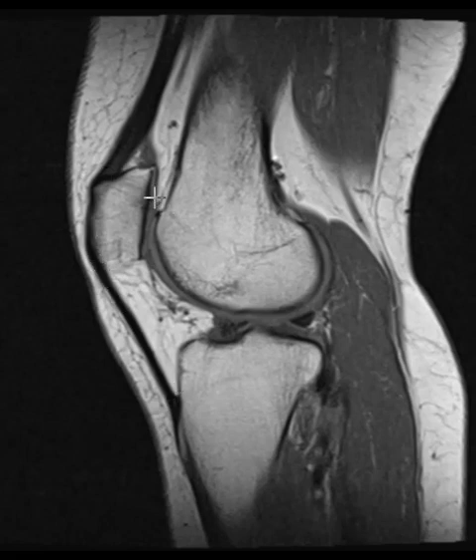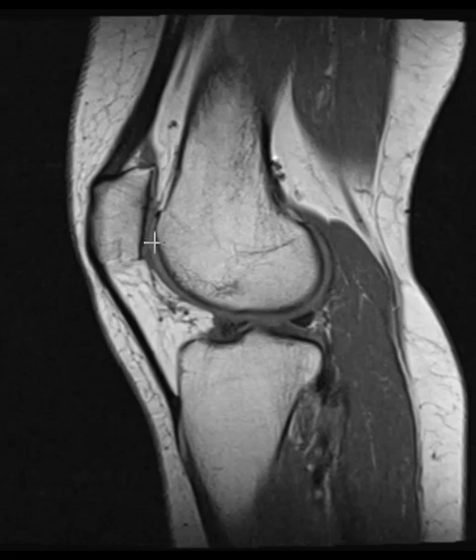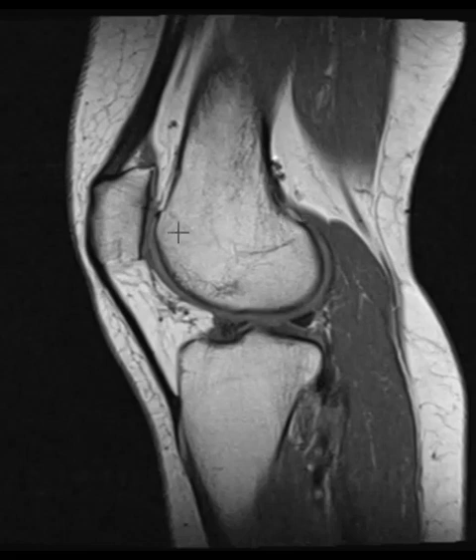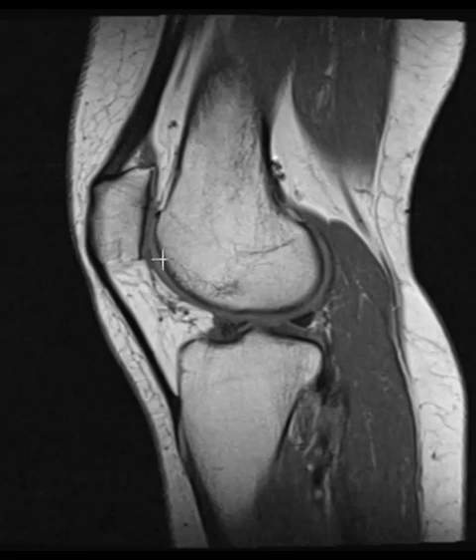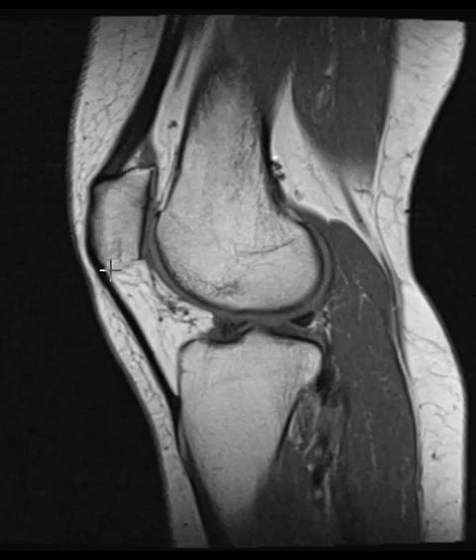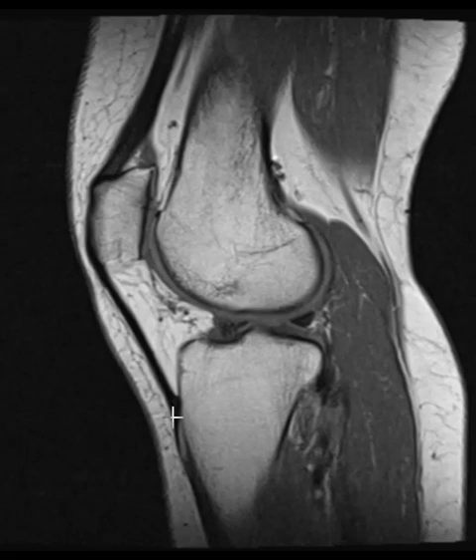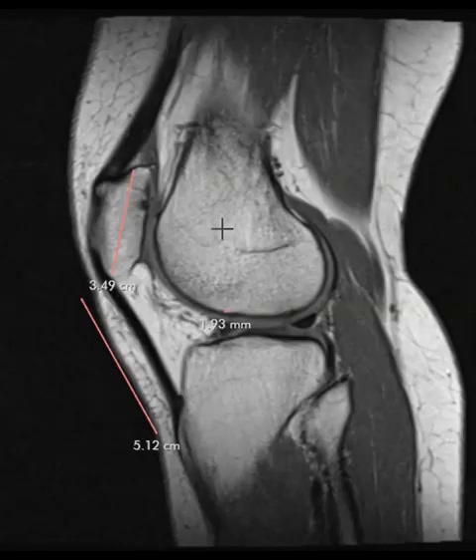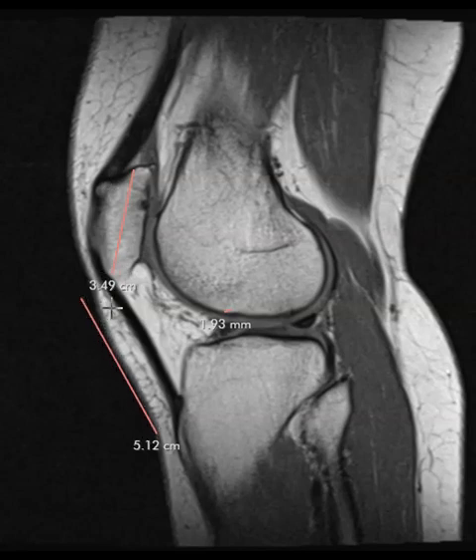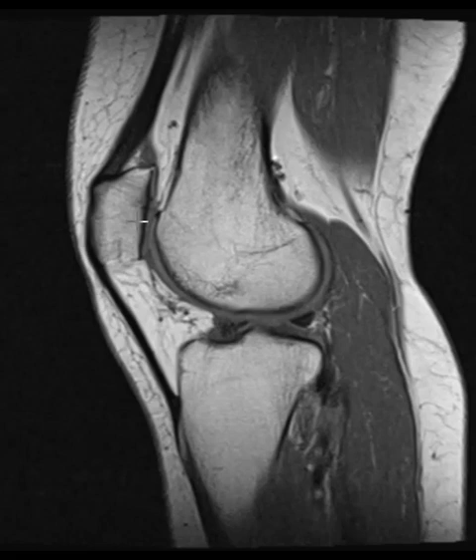We see that it is in normal position. The articular surface in back is articulating with the front of the femur here. We see the gray cartilage. The epicenter of the patella is right here and it roughly corresponds to the top of this articular surface with the knee mildly flexed. The patellar tendon should not be more than 1.5 times — or maybe 1.3 times — the height of the kneecap. We can measure that: this is 3.5 centimeters in height, and the patellar tendon is less than 1.5 times that, so this is a normal position of the kneecap.